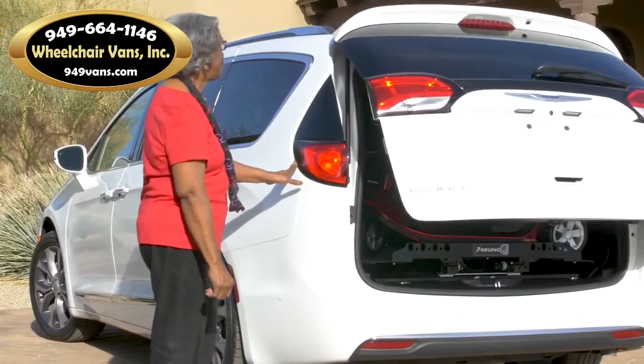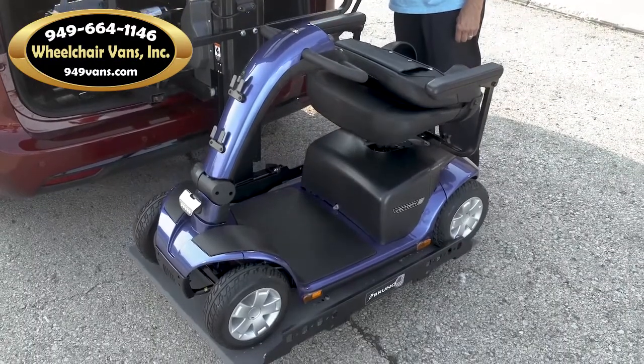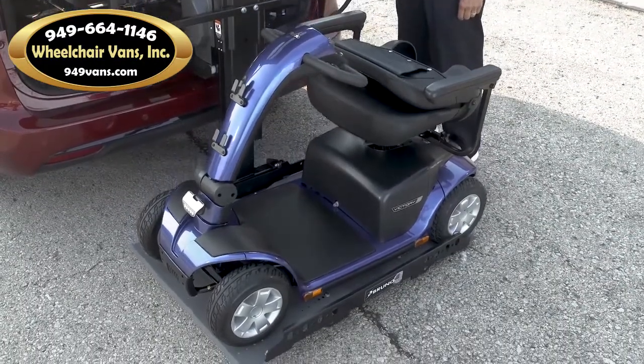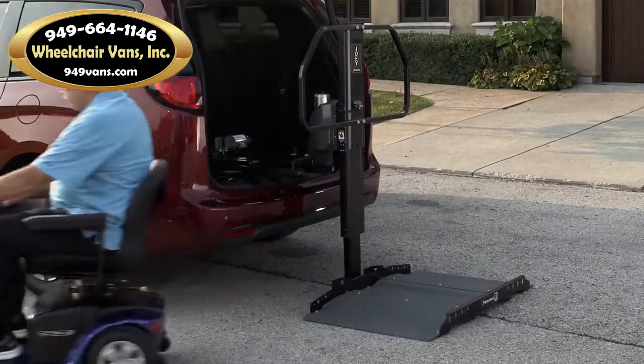Whether you're loading your scooter or power chair day or night, in the snow or sun, the Joey is the fastest, safest lift on the market. Bruno's Joey is truly as easy as it gets.